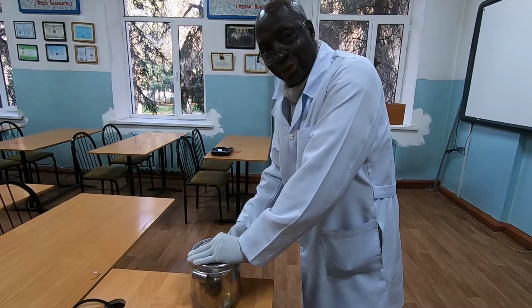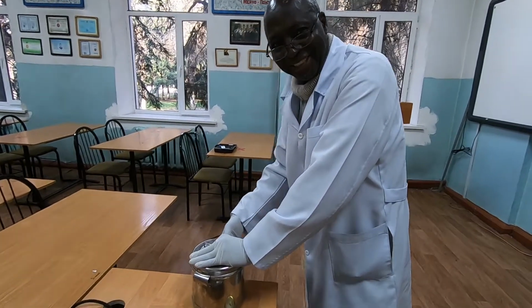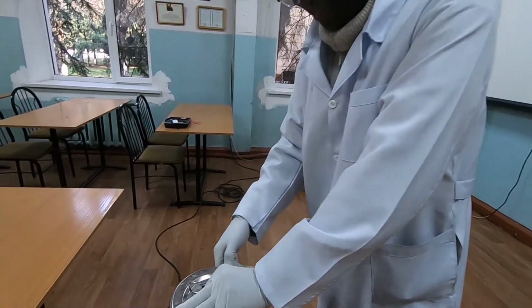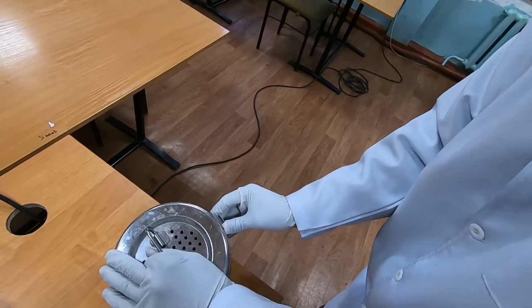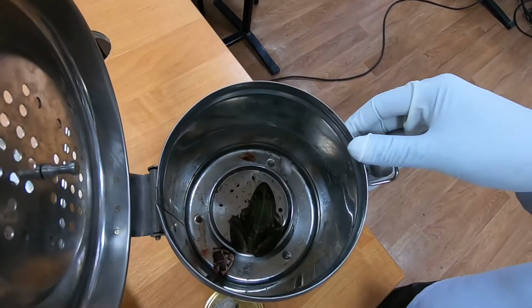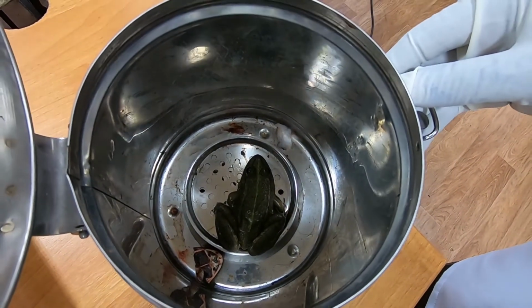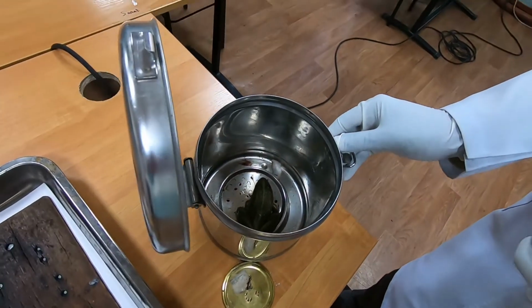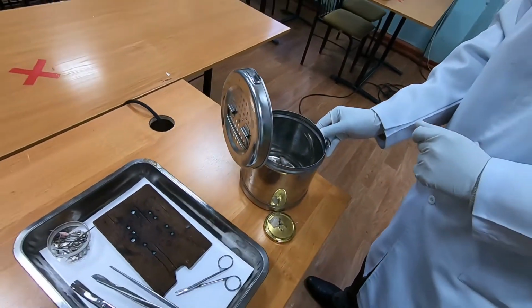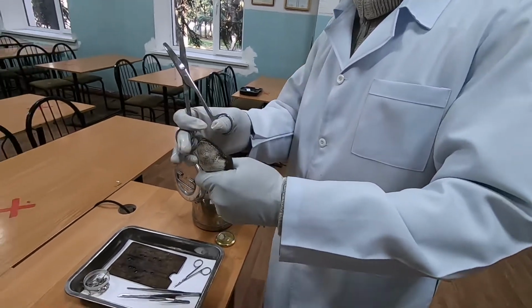Just have a look. Now we're going to bring out our beautiful frog, and it's going to say hello to you all, students. Look at our beautiful frog here. Can you see it? Yeah, it's saying good afternoon to you all. I'm going to show you how my heart beats. Okay. Dear students, this is our beautiful frog. Yes, we're going to work with it.